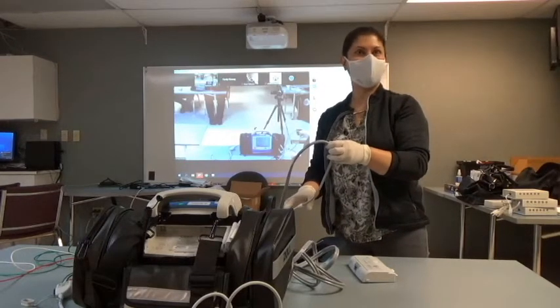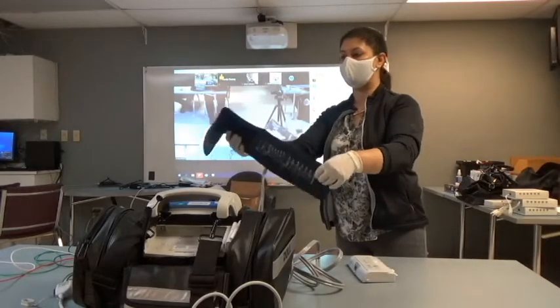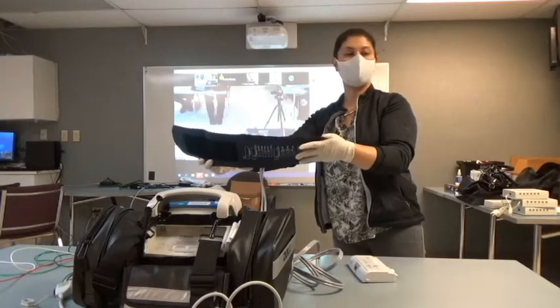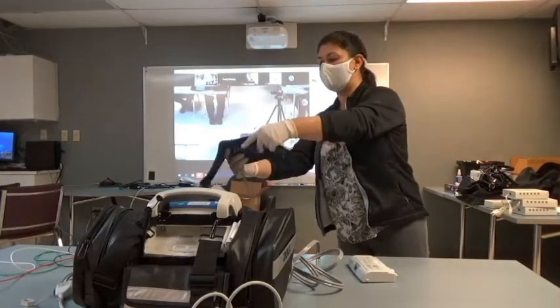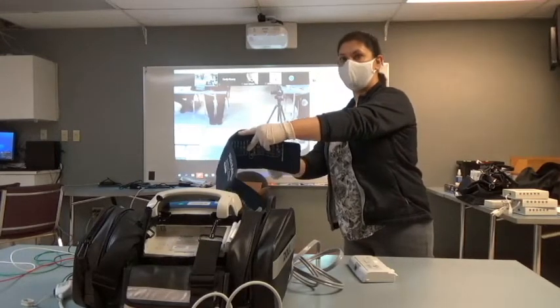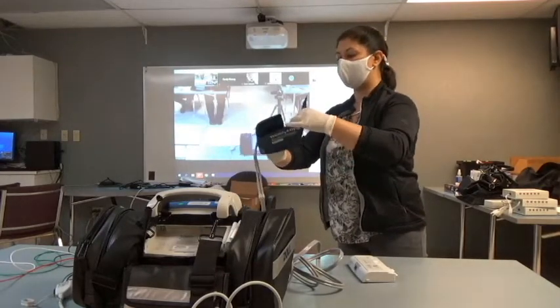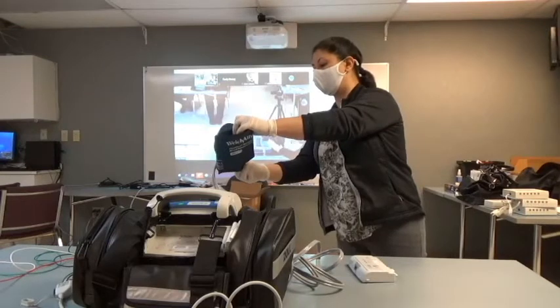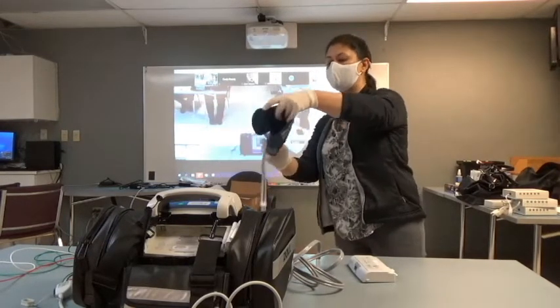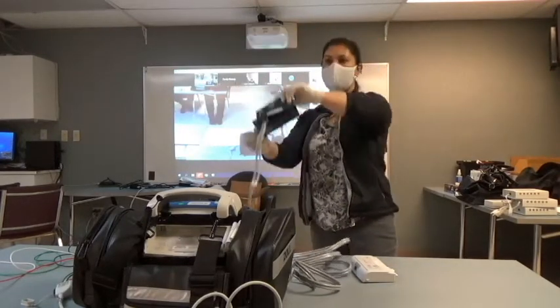Any questions about that? Okay, we can help the system out to get those faster blood pressures with three simple things. Number one, you want the cuff as close to bare skin as possible. Number two, if you open up your blood pressure cuff, you're gonna see the white artery line marker. You want that to follow the patient's artery line. And then when you close the cuff around the patient's arm, you're gonna see a little arrow in these goalposts here. You're gonna want the arrow to be inside the goalpost, and let me just switch this around so you guys can see as well. Just like that, you want it inside the goalpost.